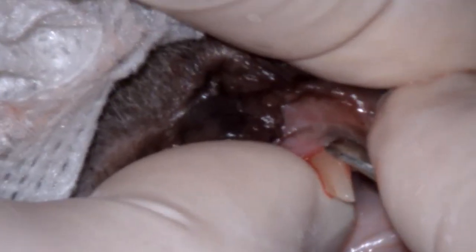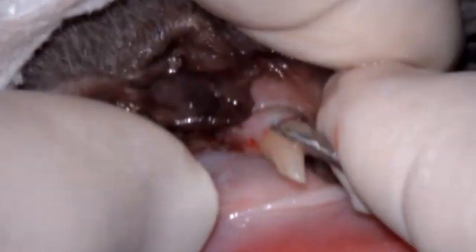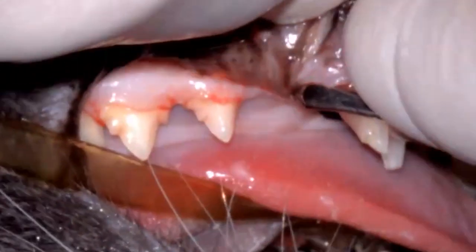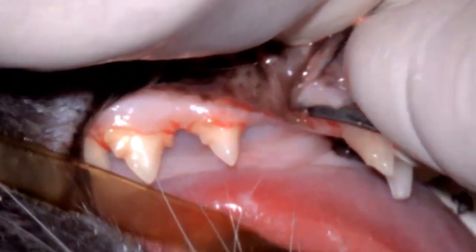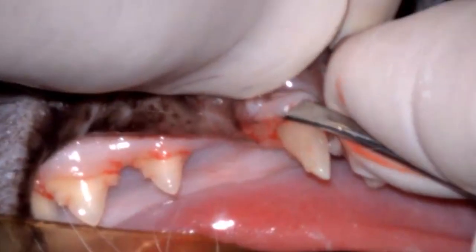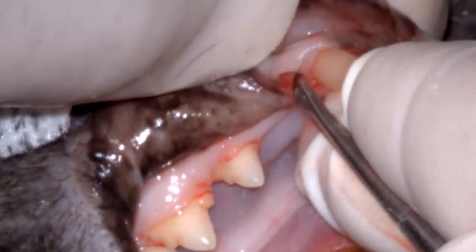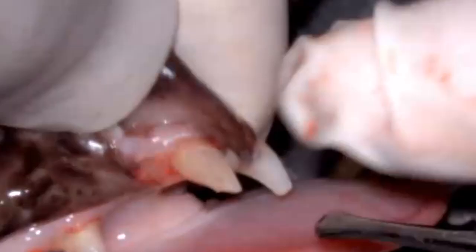I'm keeping my finger very close to the tip to maintain good control over where the instrument goes. I'm being very careful to elevate the soft tissue off the bone without lacerating or macerating it, because I'm going to need that tissue to close the wound at the end of the procedure. The end of the periosteal elevator has a gentle curve down towards the bone to ensure I'm getting all soft tissue off the bone and reducing the risk of perforating or lacerating it.